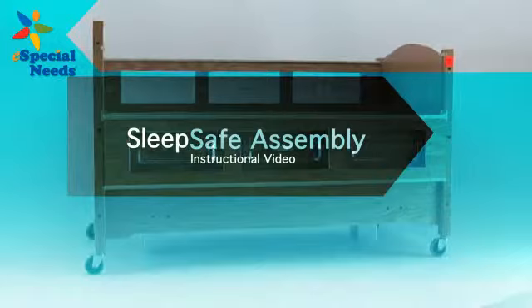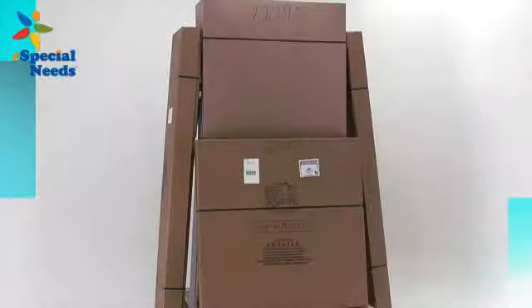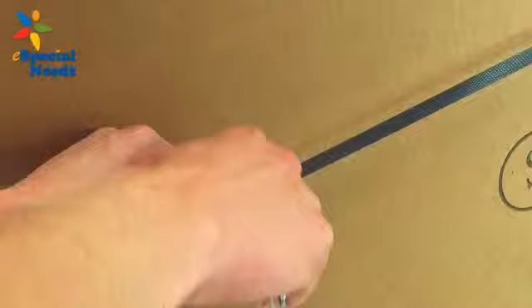Thank you for purchasing the SleepSafe 2 Hi-Low safety bed. With proper care, your bed will provide years of safe use. Before we begin, we strongly recommend that this bed be assembled using two people.